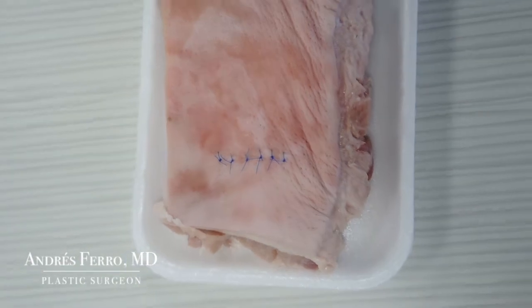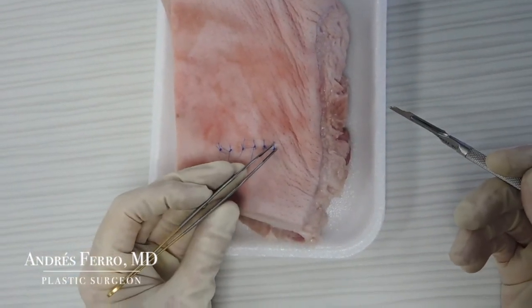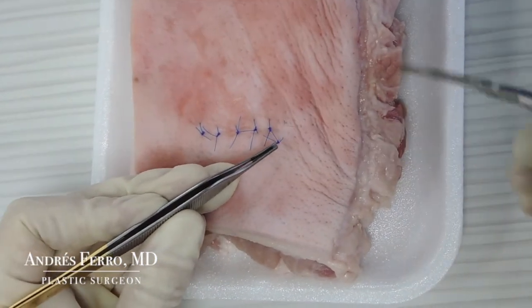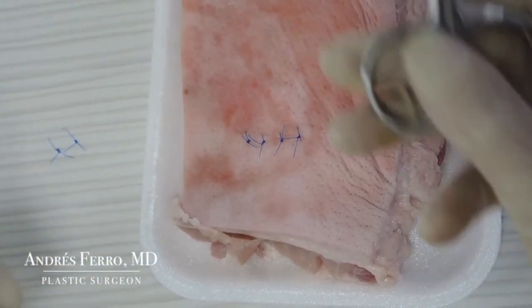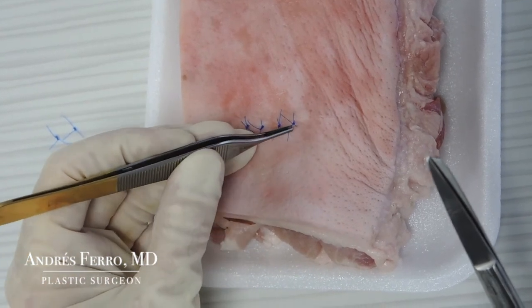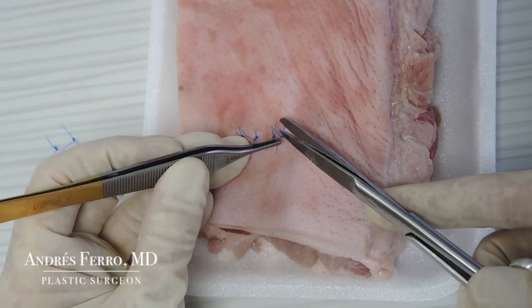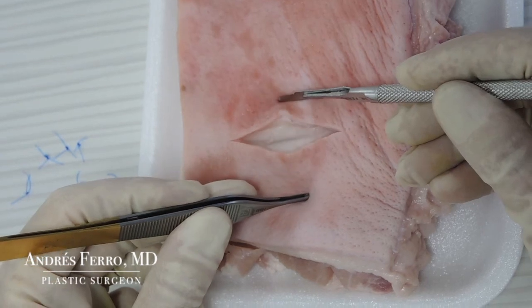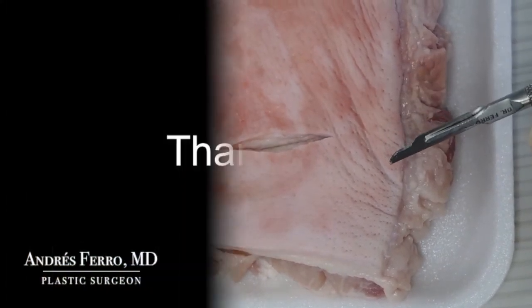For the stitch removal, use forceps to pull one end of the knot and, with the scalpel blade's cutting edge facing on the opposite side of the skin, cut and remove each stitch. You can also remove the stitches with scissors: take the knot with forceps, insert the scissors blade into the knot and make the cut. Continue until removing all the stitches from the wound. Thank you.